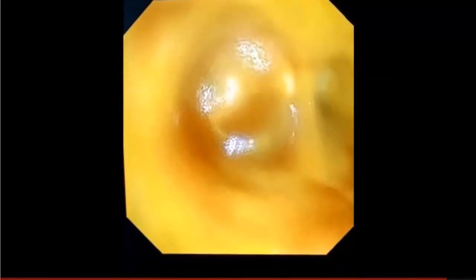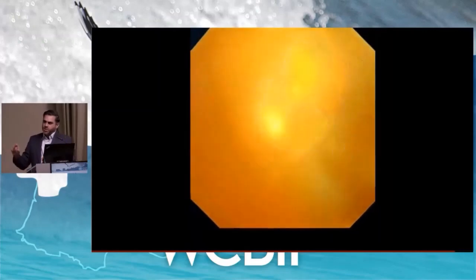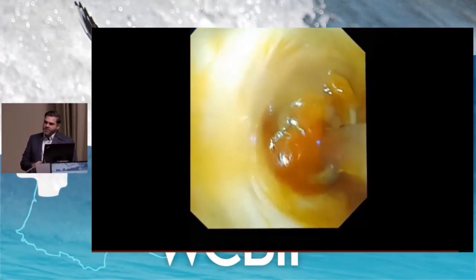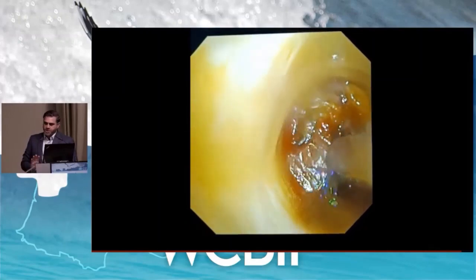but here we go. With a flick of a button, we flick to the RDI. It takes away all that surface blood, and you can now just start seeing that very focal area which is bleeding. So I just put the blunt forceps, this is the Olympus electrocautery, through the channel of the bronchoscope, saw where it was bleeding from, and then just coagulated it.